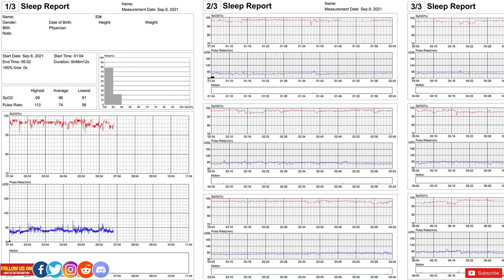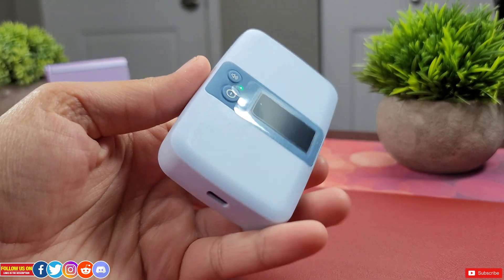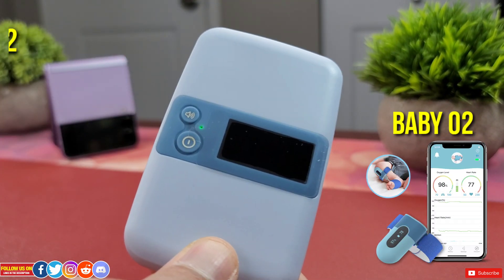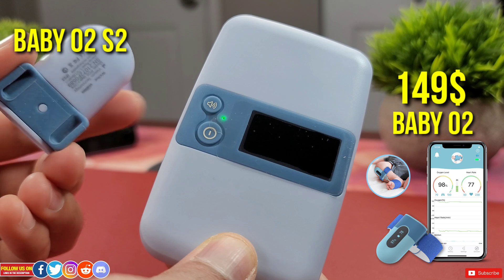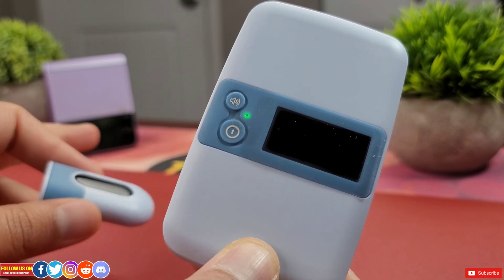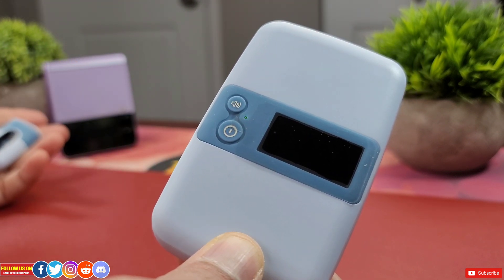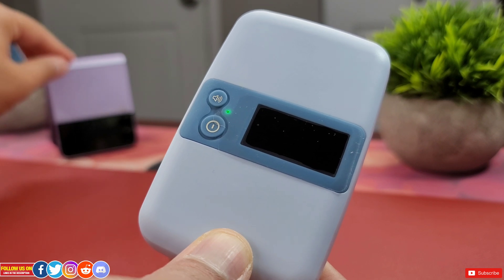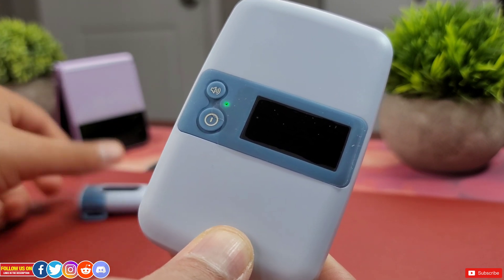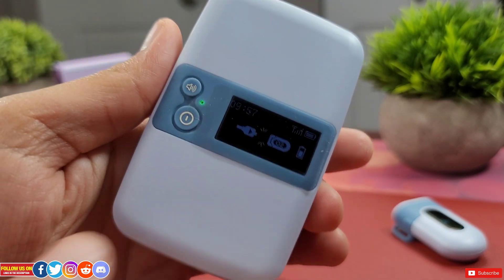The base station is very compact and lightweight, and is the primary difference between the Baby O2 and the Baby O2 S2 — the Baby O2 is only $149 USD but does not include the base station. If you're fine using the mobile app, you don't need to spend the extra money. But if you put your phone in Do Not Disturb mode at night or avoid keeping your phone near you while sleeping, the base station is a worthwhile option — it connects directly to the Baby O2 S2 unit without needing to pair with a phone.